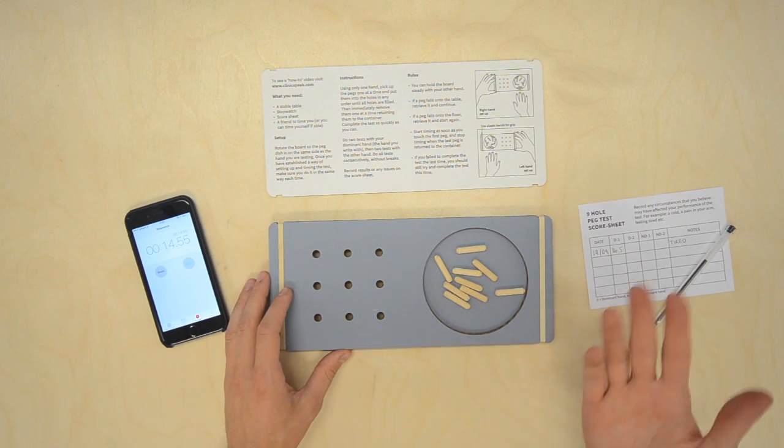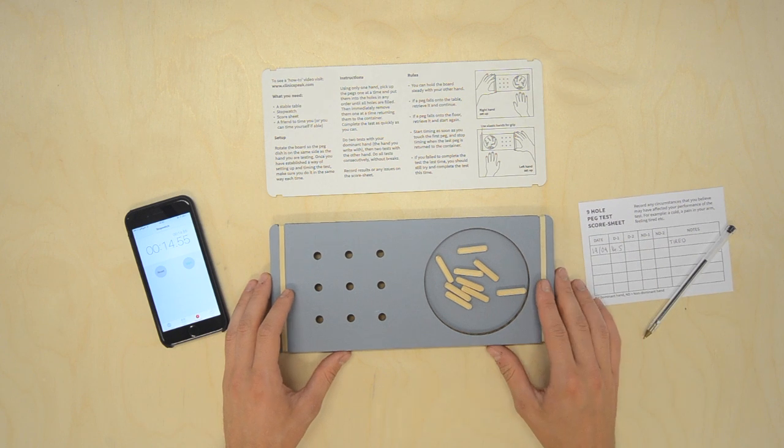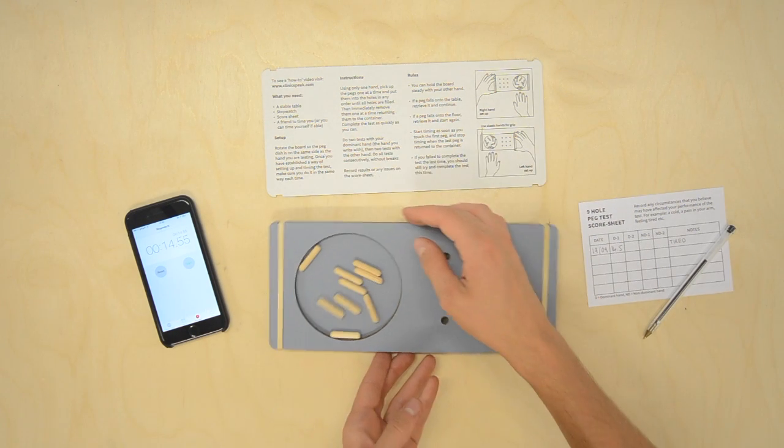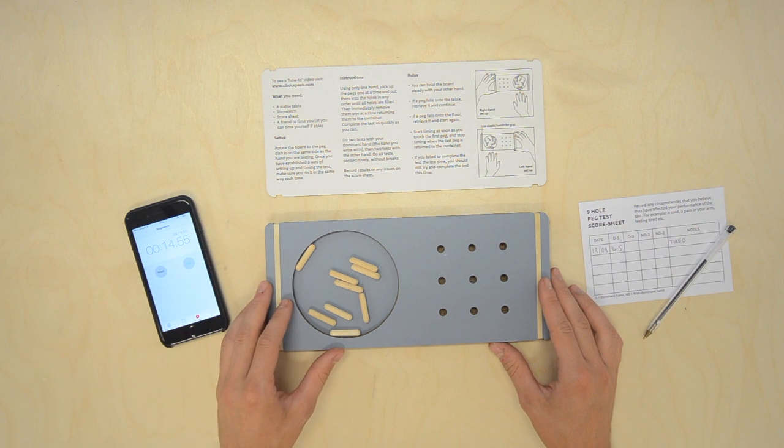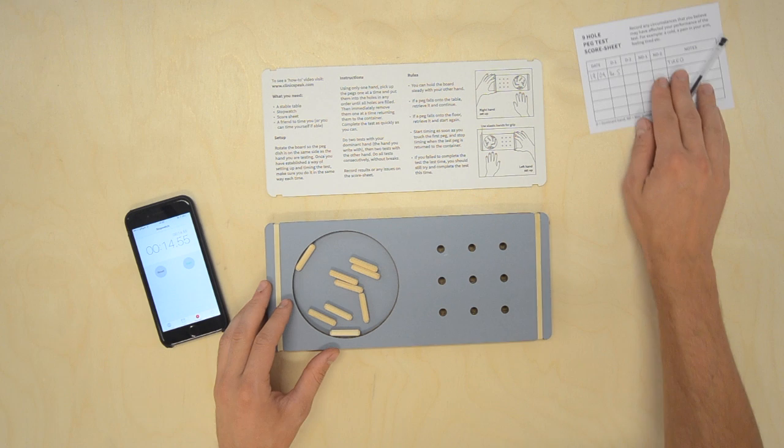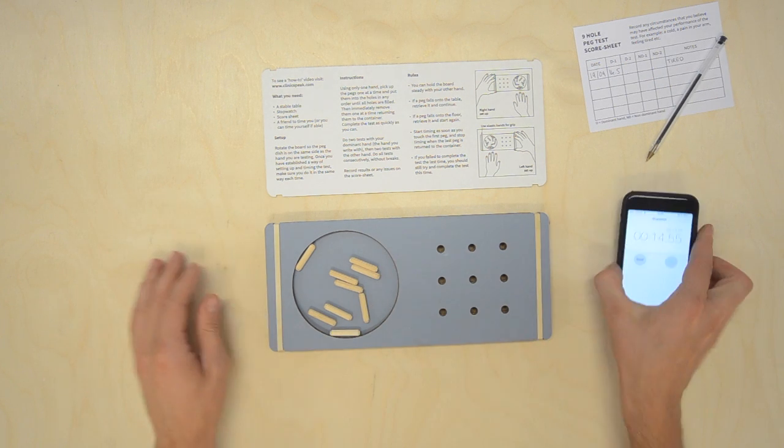Do two tests with your dominant hand. Once you have completed these two tests, rotate the board and do two further tests with your non-dominant hand. You need to do all the tests consecutively, without breaks.